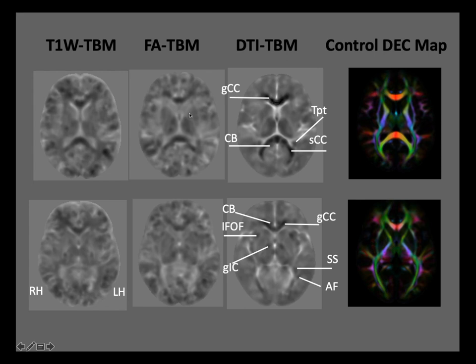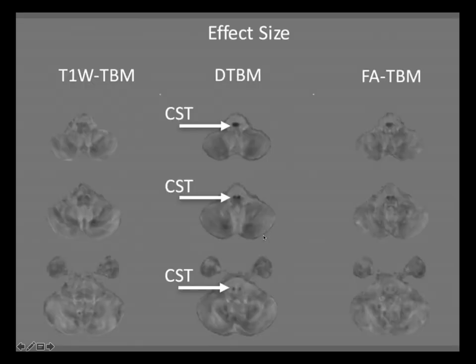And you can see it throughout the brain, right? And even if you go down to the brainstem, it is beautiful because you can see here that of the tiny brainstem, the actual fibers that are affected are the motor fibers. This is the location of the motor fibers.